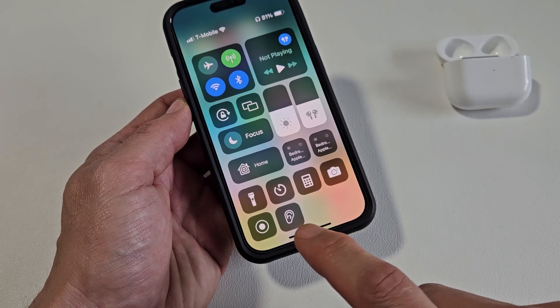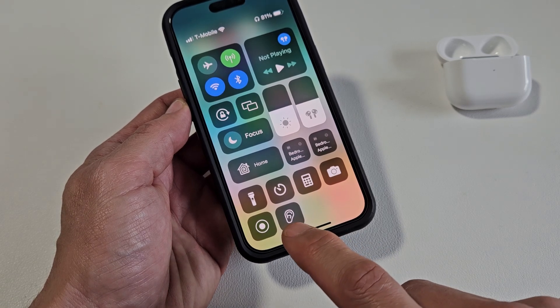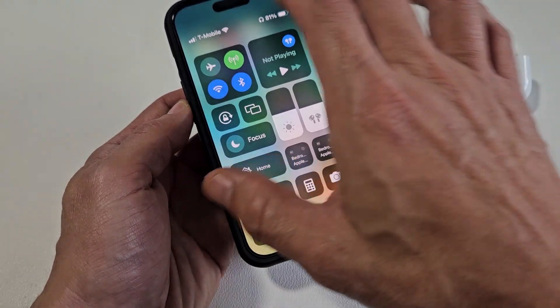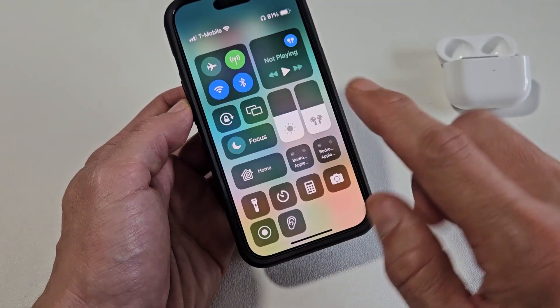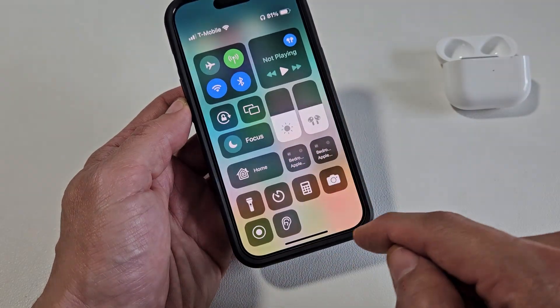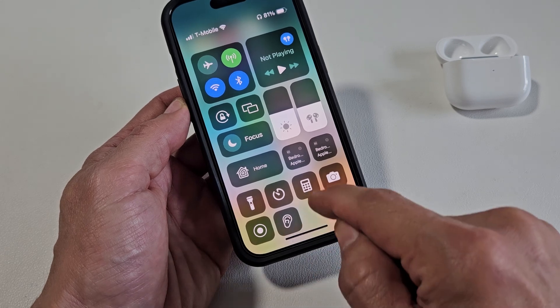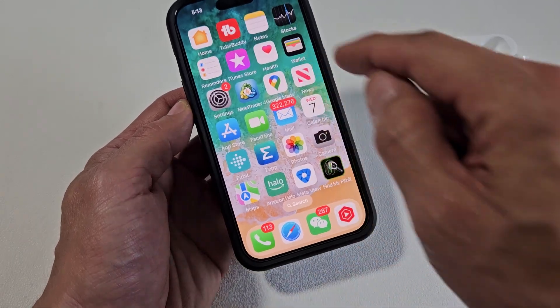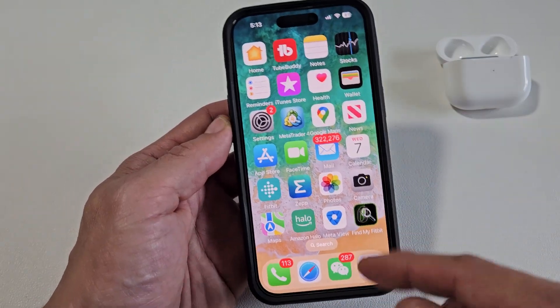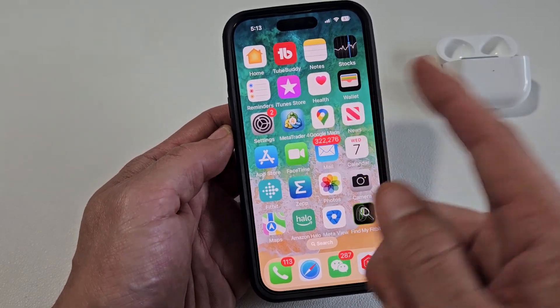I'm going to show you how to add Live Listen on your control panel, which is right here on your iPhone. You're probably missing this right down there, and I'll show you how to add that on there.